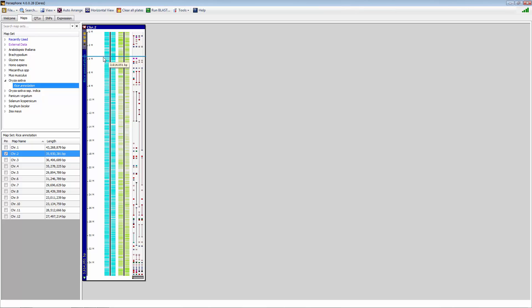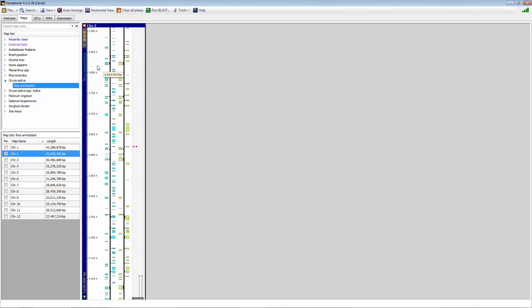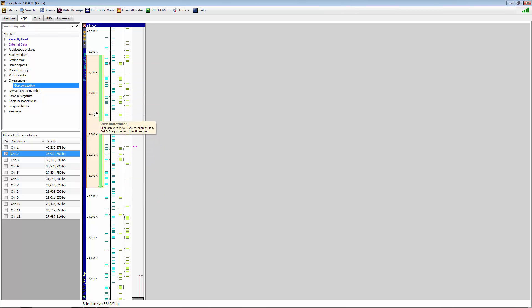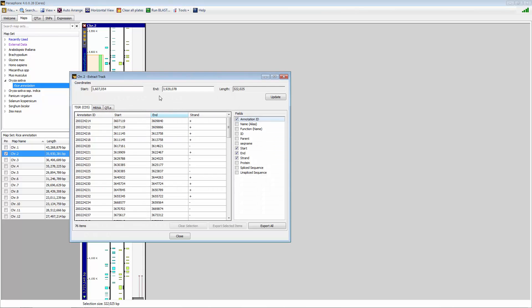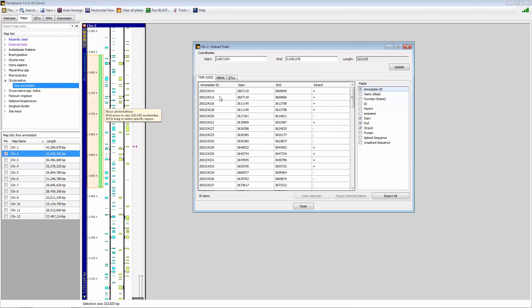Also, if you wanted to select a given region, you can zoom into a region by using the shift key, and then you can select a given region by using the control key and the left mouse button to select a region in green. Once you select that region, you can right click on it, and you can export track, and now it gives you only the information in the tracks under the green highlighted bar.